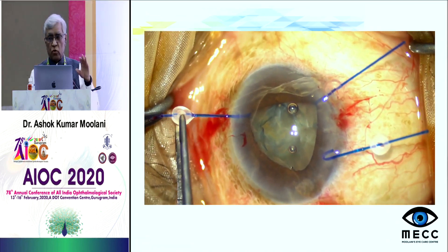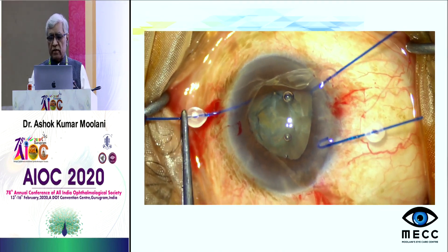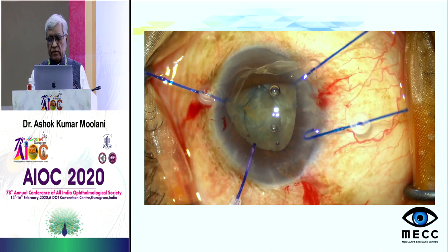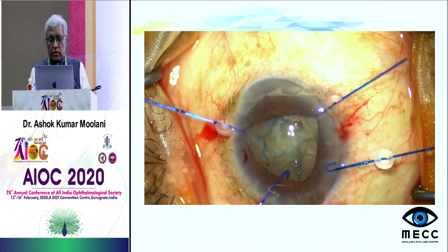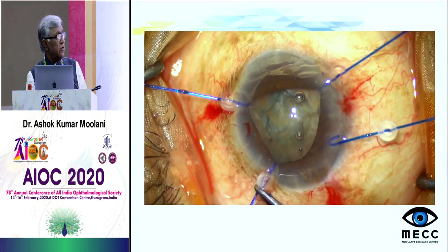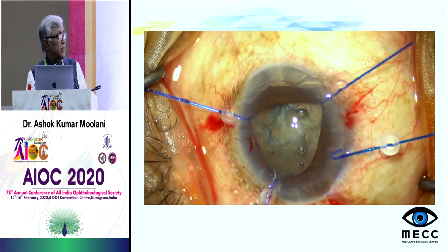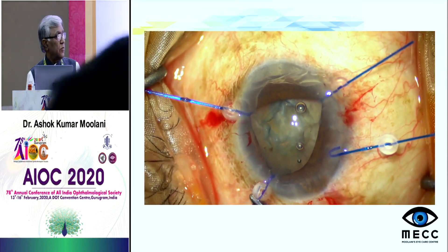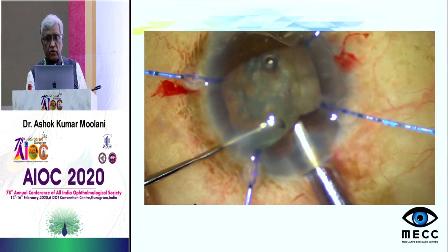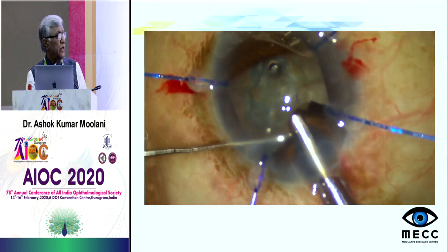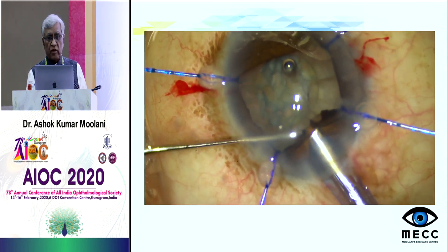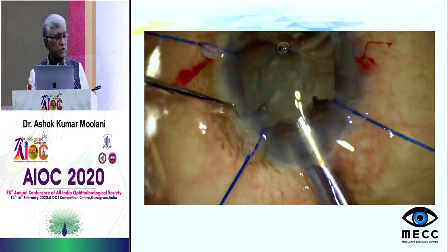Always put OVD between the iris and the anterior capsule to create a space for iris hooks to be placed. You can see in this video that in spite of using iris hooks, putting the phaco probe was difficult because of the floppy syndrome — the iris was coming in the way of the phaco probe and making the procedure difficult.